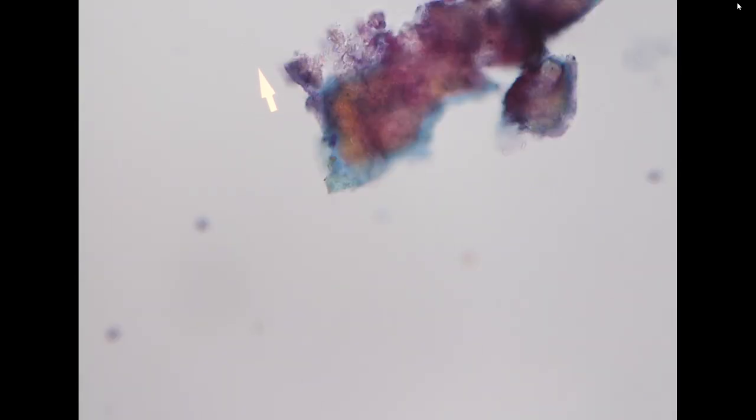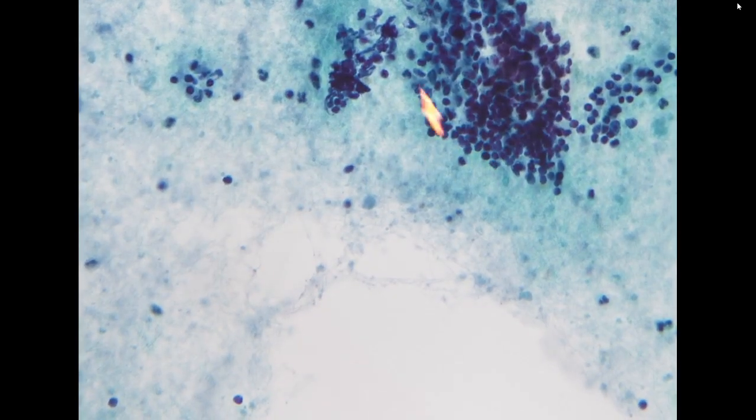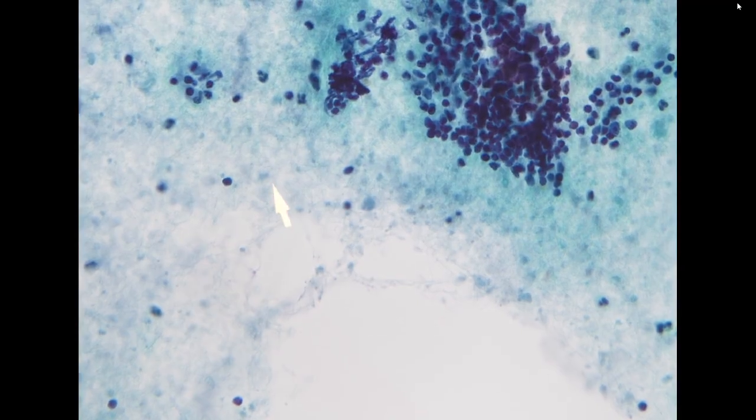And in the background, we can also appreciate there is some cystic degeneration debris. So this is typical for a Warthin tumor. Sometimes you will have some calcification, like crystal material, which is also okay. In this specimen, you also see there is some lymphoid stroma, lymphocytic stroma, mixed with the granular debris.